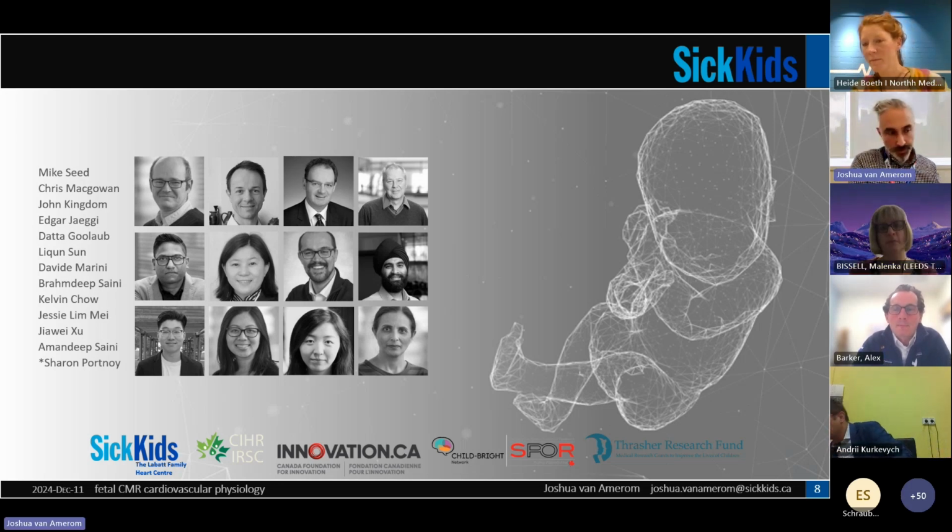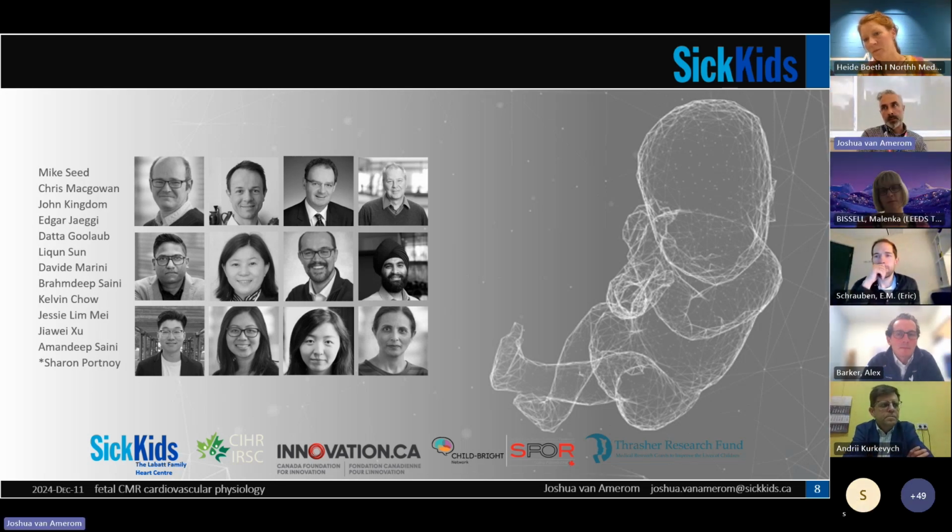I can start on that. I think low prescription complexity and redundant, motion-robust acquisition is the way to go. That's just based on my own background, being non-clinical, but also on what I've seen work quite well, in the fetal brain for example.